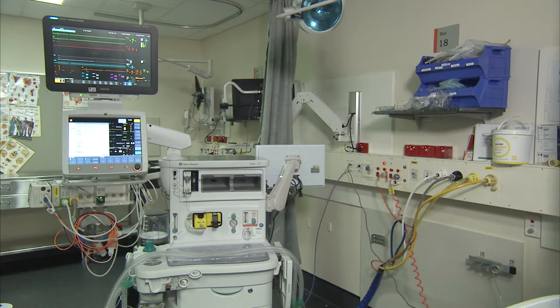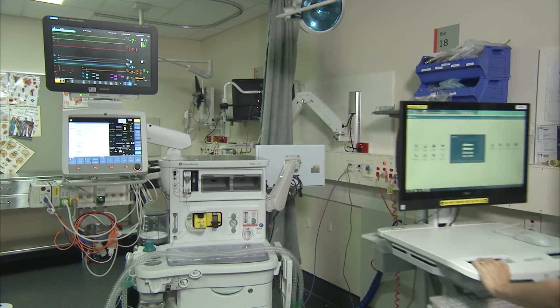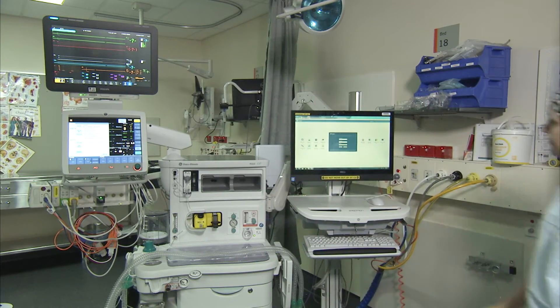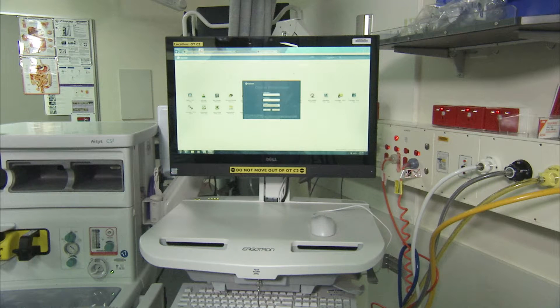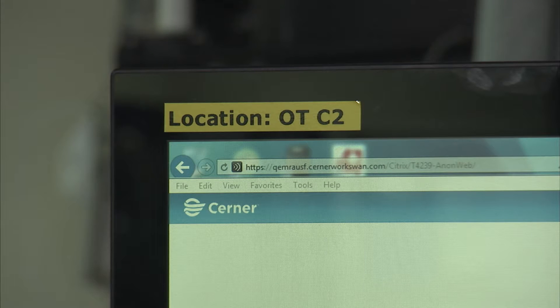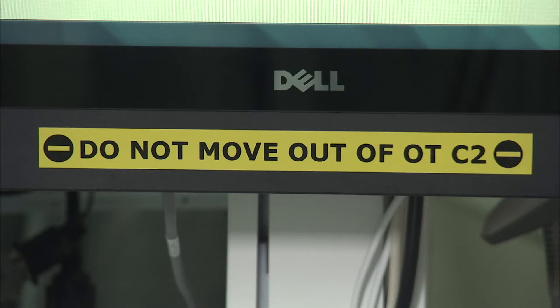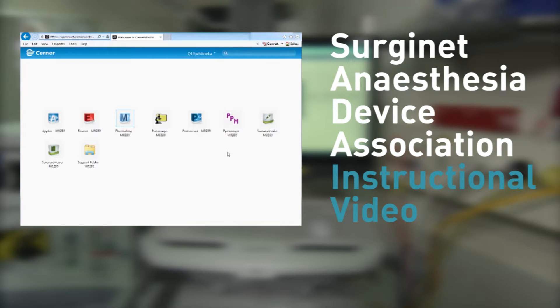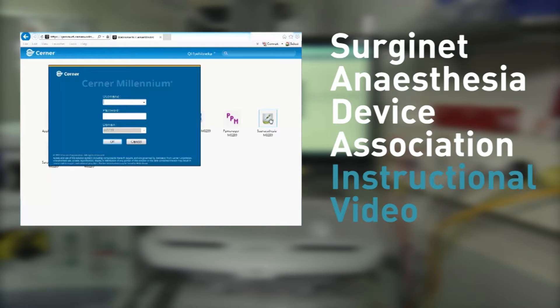Next, you will need to utilise the correct SurgyNet anaesthesia WoW for your designated operating theatre. This will ensure your WoW automatically connects to the required anaesthetic devices. All WoWs will be very clearly labelled as to which theatre location they belong to. If you find yourself in an out-of-theatre location that does not have a designated WoW, you will need to refer to the SurgyNet anaesthesia device association instructional video for guidance on manually associating anaesthetic devices.